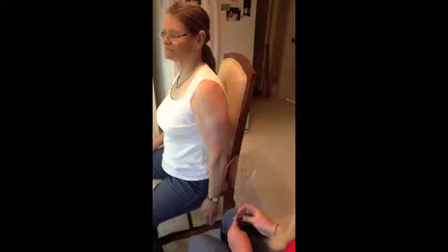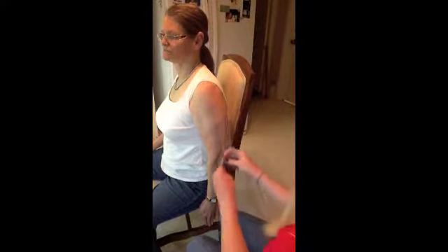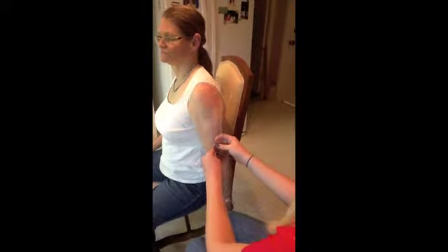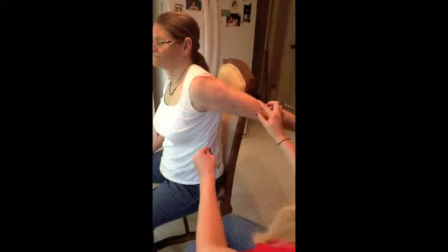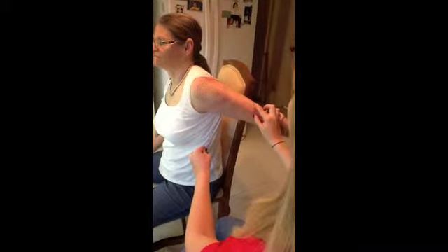For shoulder extension, the subject is seated with no obstruction behind the humerus, and the humerus is in a neutral position. The position of the goniometer is the same as it was for shoulder flexion. The client's arm is brought to the back of the body in a sagittal plane of movement. The measurement begins at 0 degrees and ranges to 60 degrees.